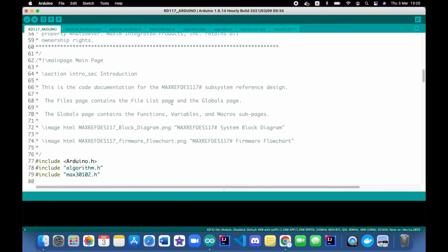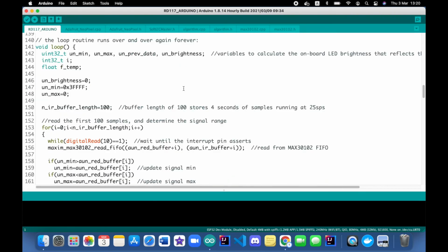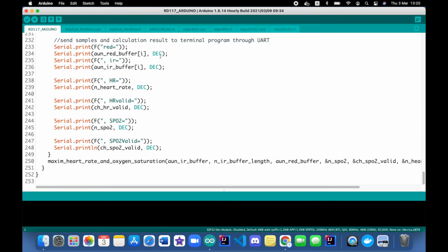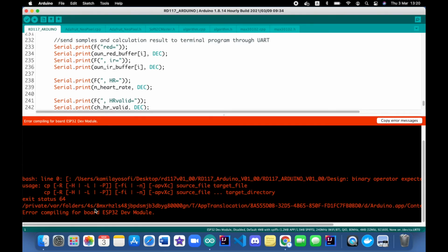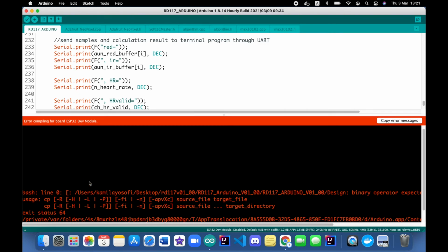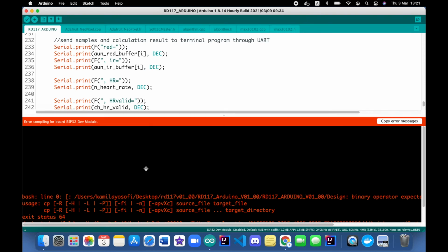Basically, there are now so many other libraries that have used the code here from some better libraries, and the one that I used right now is just taken from the original ones, with simple basic code that does the job this thing does. But this one will not run. You see, this is a small error, and if I go to the place that it refers to and comment that part out, it doesn't say like that here, but if you run it on Windows or Linux, then you will see so many lines of errors. Yeah, this was about the original one.